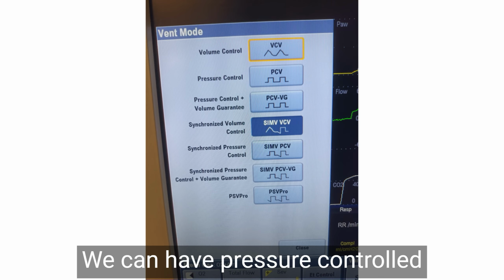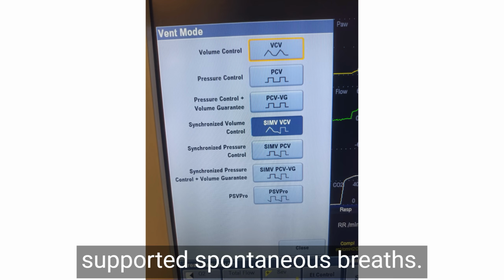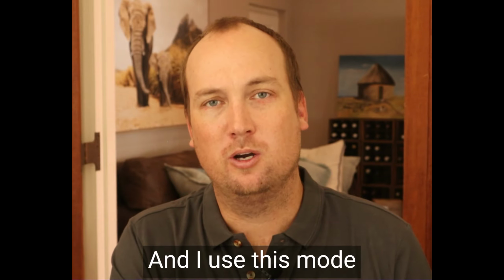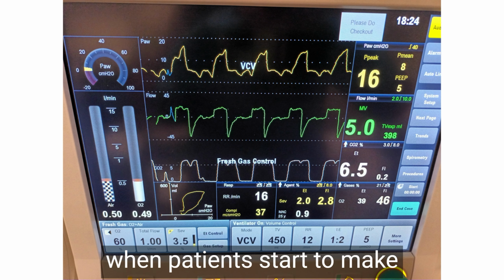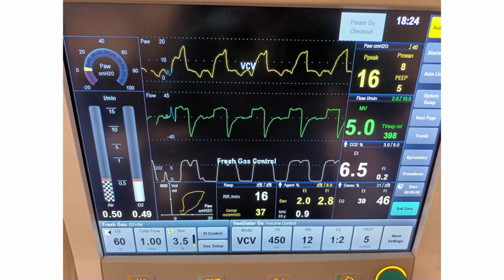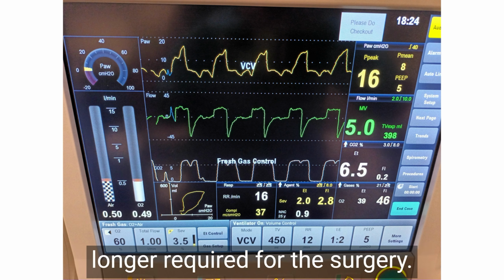We can have pressure-controlled mandatory breaths with pressure-supported spontaneous breaths. So there are a number of different combinations. And I use this mode of ventilation, SIMV, when patients start to make spontaneous respiratory efforts and when muscle relaxation is no longer required for the surgery.